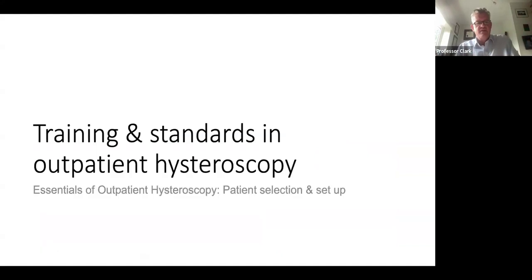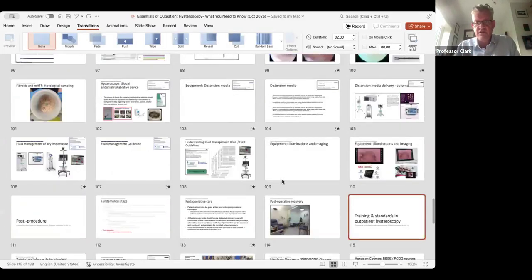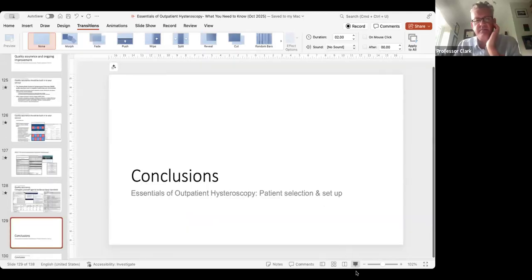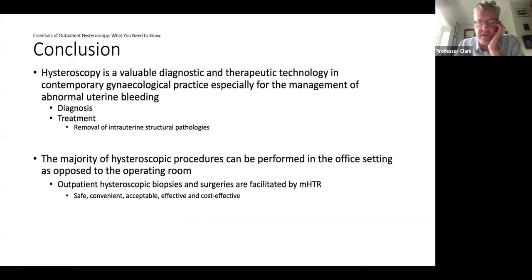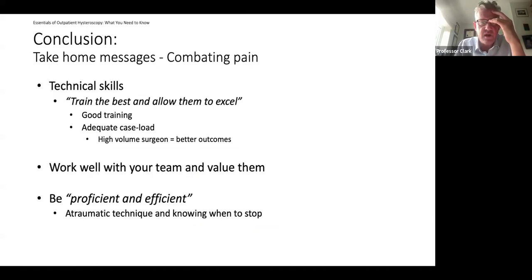Okay. So I'll cover training and quality assurance in later webinars. I've overrun slightly, but I'd just like to conclude and say that hysteroscopy is valuable in both diagnosis and therapy. Most procedures can be performed in an outpatient setting. It has the advantages of safety, convenience, acceptability, effectiveness, and cost effectiveness. Be aware of the guidelines and the good practice papers that I've alluded to in the talk.